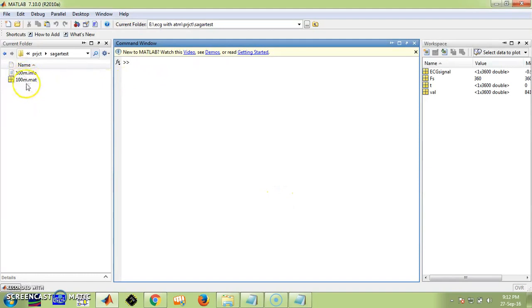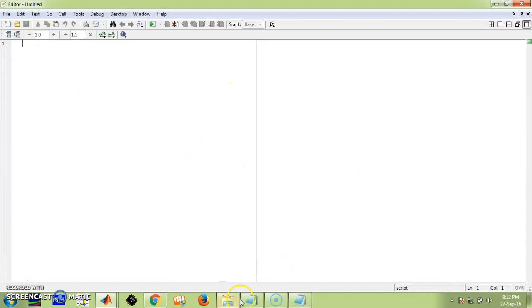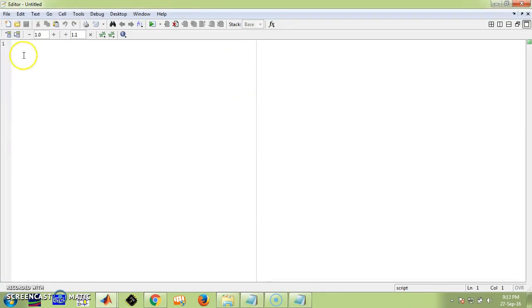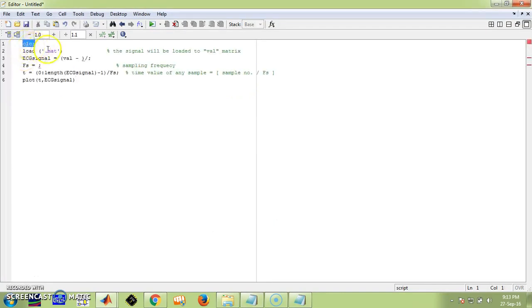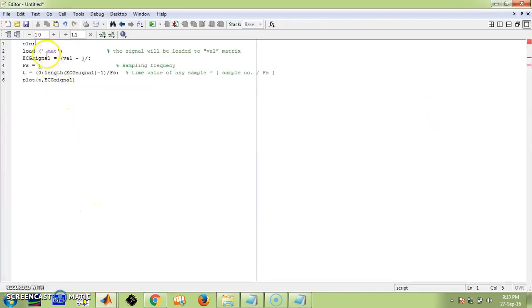Once these files are available in the current folder, go to a new script where we need to write the code to load the database in MATLAB. To load any file in MATLAB, CLC clears the command window every time we run the program. Now write the load command specifying which file we need to load — the 100m.mat file.